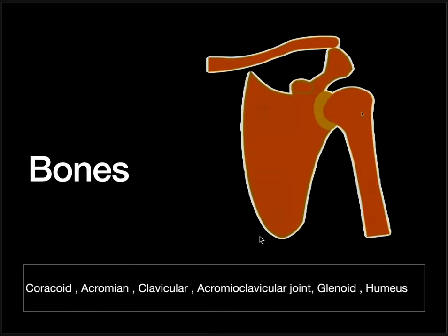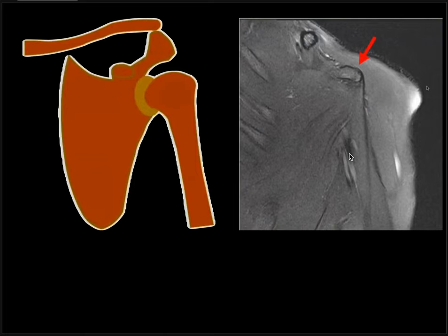Starting first with the bones. This is a diagrammatic representation of the scapula having a coracoid process, spinous process, and acromion process. This acromion process is articulating superiorly with the clavicle. We can also see the glenoid fossa which is articulating with the head of the humerus. On this MRI section, we can see this bony part — this is the coracoid process. The importance of this is that it is the most anterior bony projection, so if we can see the coracoid, we know we are in the anterior sections of the film.